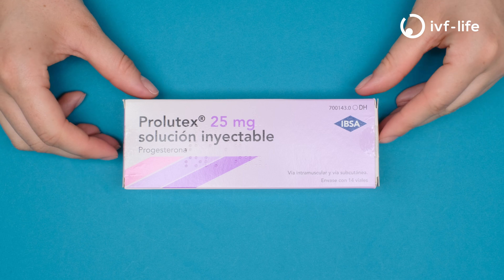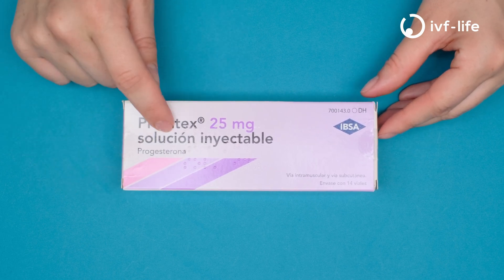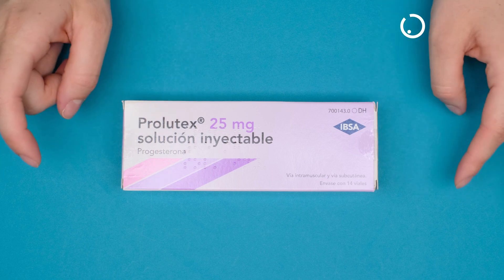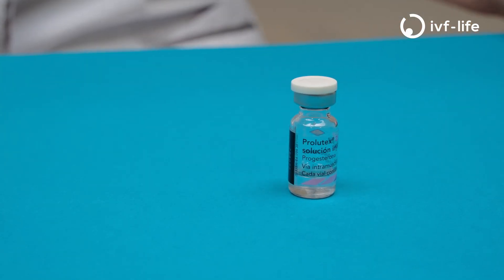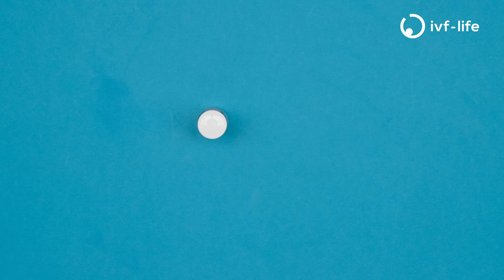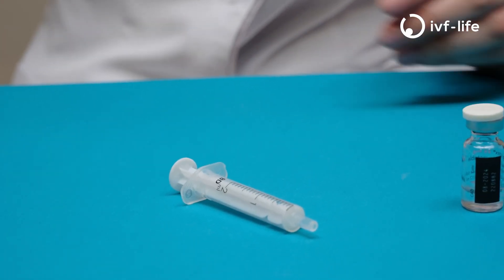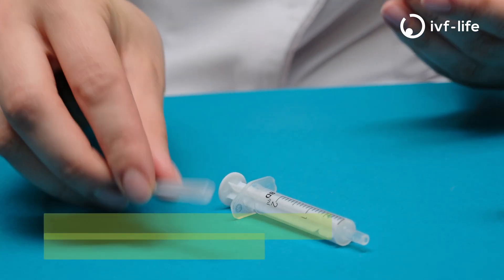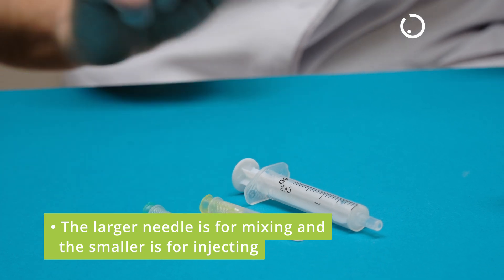These are the instructions on how to inject Prolutex 25 milligrams. In your box you will have either seven vials or 14. Remove one of the vials from your box. You will also need to obtain a one or two milliliter syringe and you will have two needles — one larger for withdrawing the medication and the smaller one for injecting the medication itself.